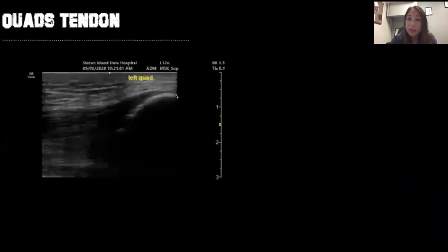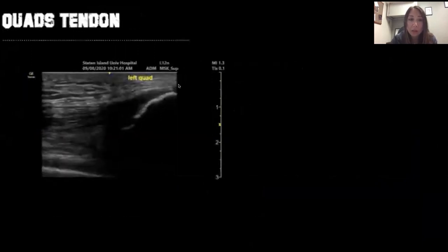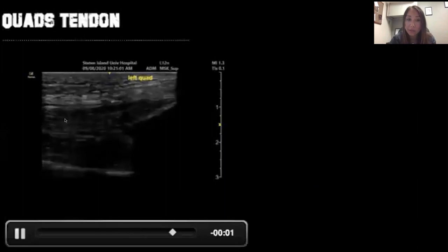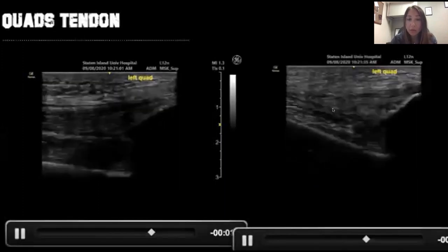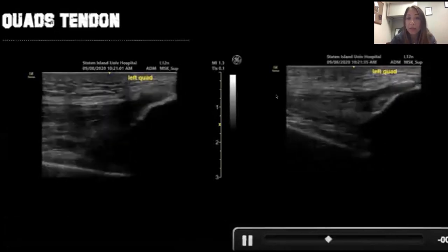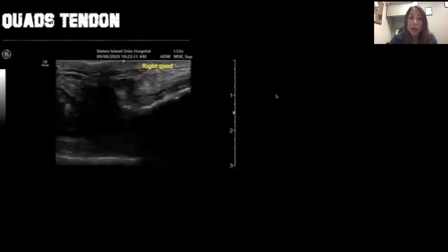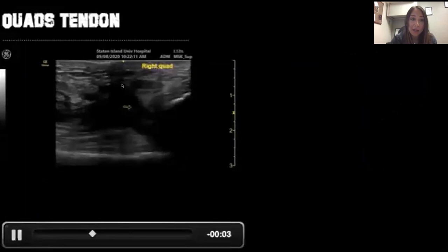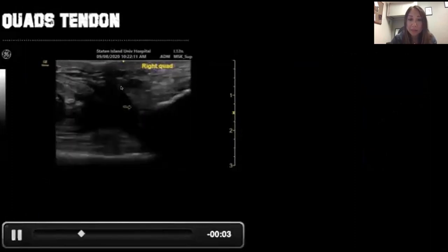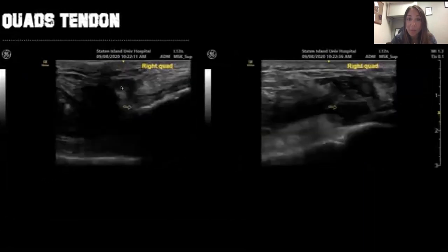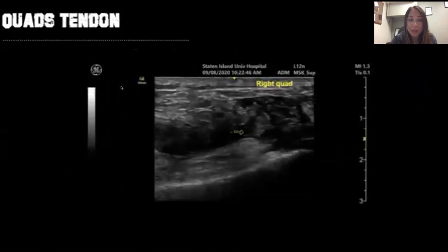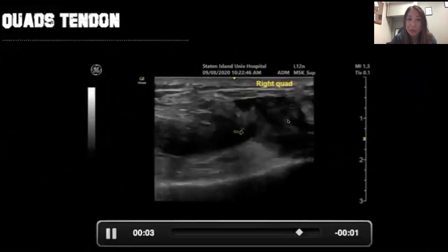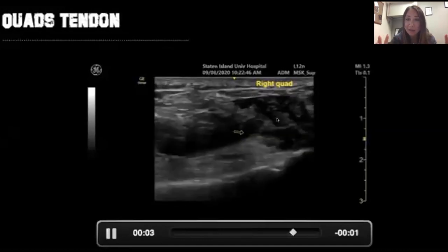Here's how to evaluate the quadriceps tendon. You find the quads tendon inserting onto the patella and scan cephalad. Normal quads tendon has that beautiful paintbrush fibrillar appearance. As opposed to a ruptured quads tendon where you can see it's disrupted, losing that fine appearance with hematoma and lots of fluid around the tendon. In another example you can actually see the fluid squishing around the tendon and the disruption.